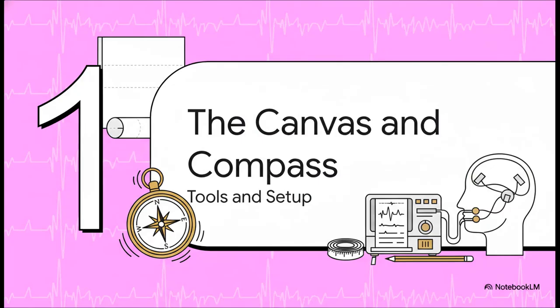Okay, section 1, the canvas and compass. Look, before an artist can paint a masterpiece, they have to prep their canvas and know their tools, right? Same thing here. This part is all about getting the foundation right, because everything else we do builds on this.